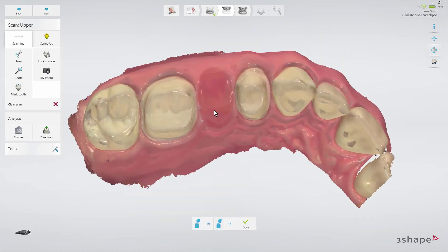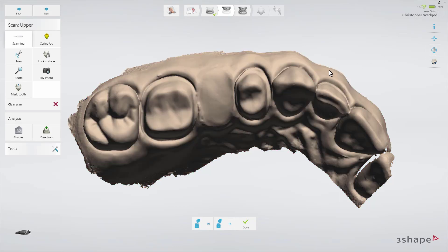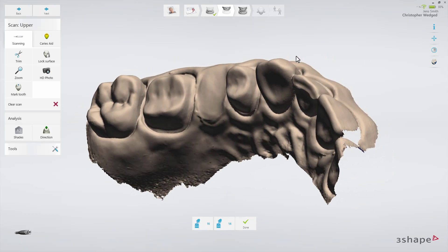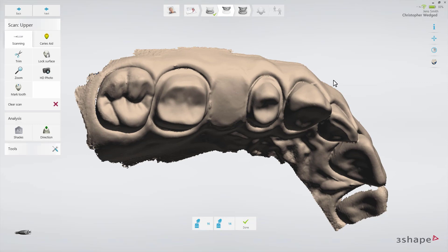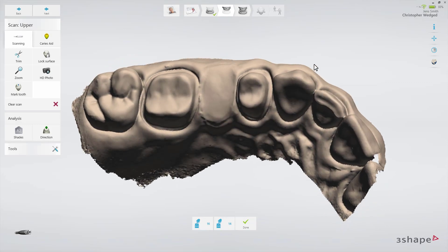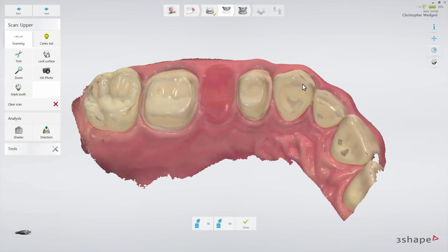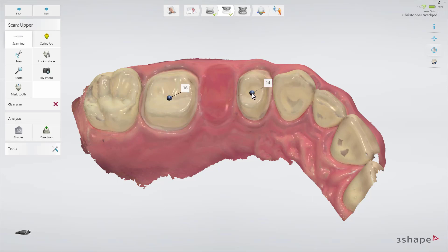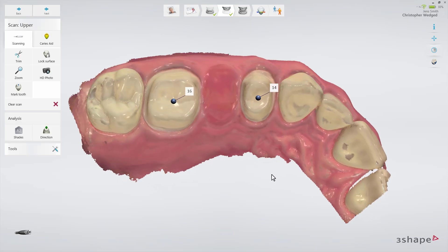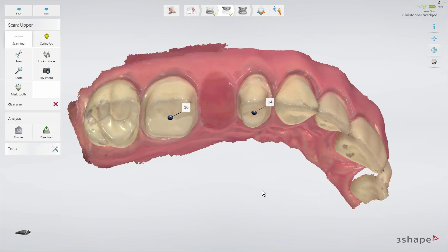Verify this by zooming in on the preparation, turning off colors, and rotating the preparation. Finally, mark the preparation using the prep mark. Once you set the prep mark, the software will automatically check if there are any areas near the preparation that have not been scanned. If any holes are found, you will be informed by a pop-up.